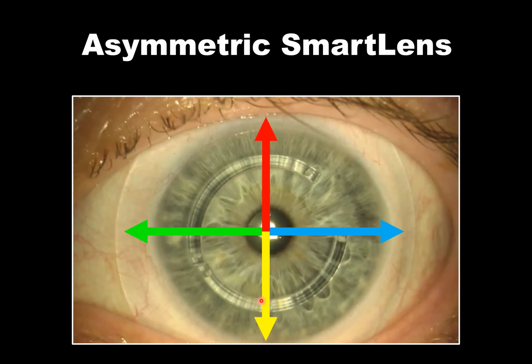So you have the ability to land a symmetric smart lens surface. You can fit a toric landing, or you can lift just one section of the lens. You can create an asymmetric. You can make the elevation of each one of these 4 quadrants completely different, making it utterly asymmetric. It's more common to use one of the axes to lift or drop the surface, especially when you have a pinguecula. This may be the most common reason to use an asymmetric smart lens.